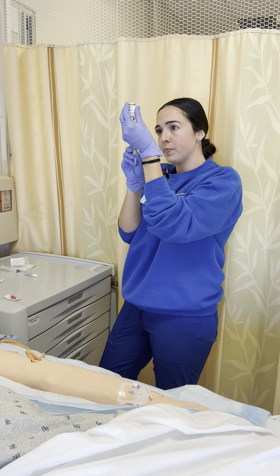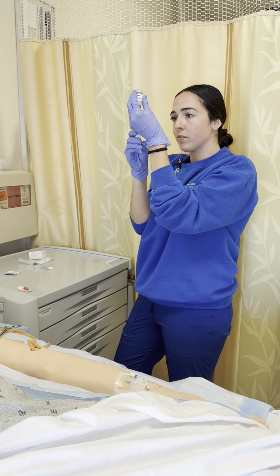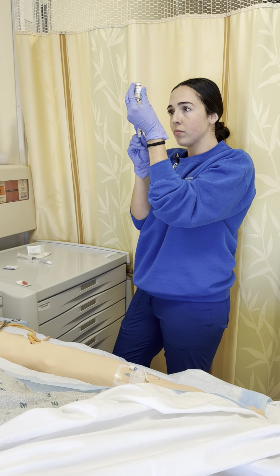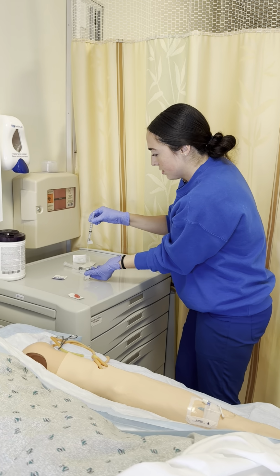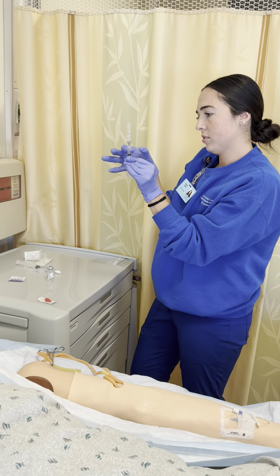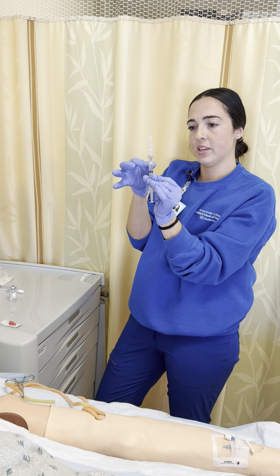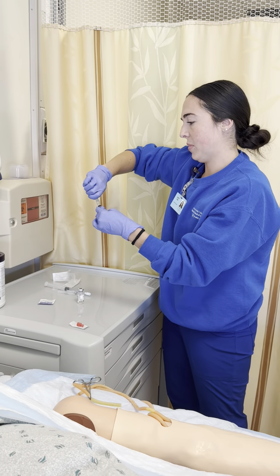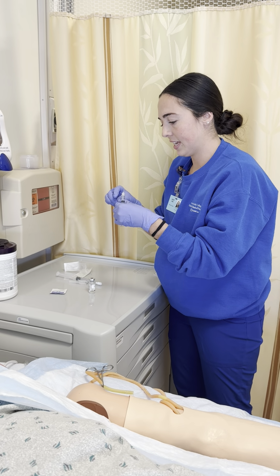One air bubble. Okay. Perfect. I'm going to engage my safety because I no longer need the needle. Again, make sure if there are any more air bubbles that came up that they're gone. Looks perfect. I'm going to get rid of my needle, and I'm going to place a red cap on.